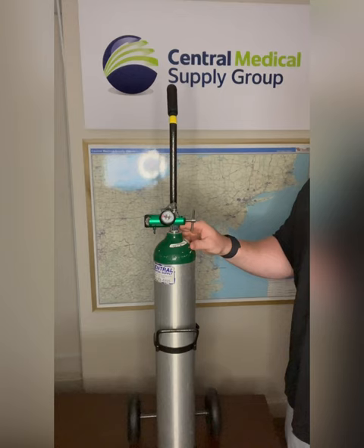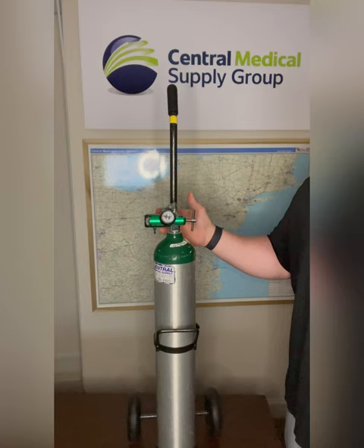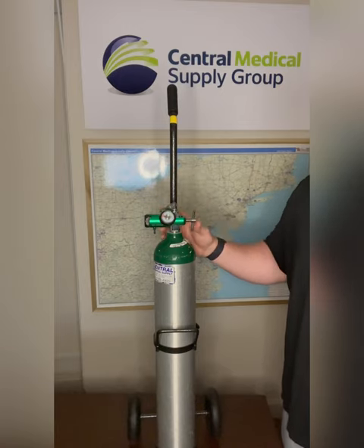This will give our technician plenty of time in case of an emergency to come bring more tanks, in case of a power outage or to service and replace the concentrator if it is malfunctioning.